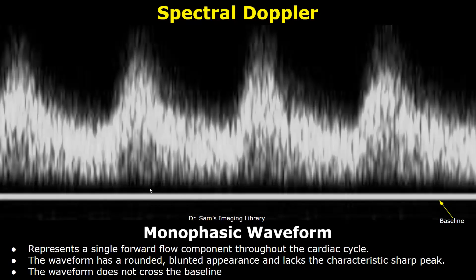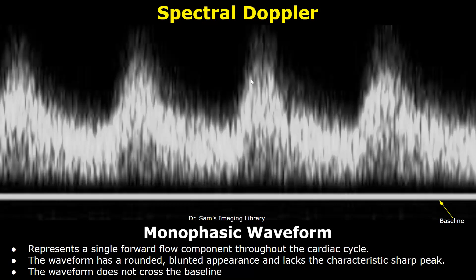Usually whenever a waveform is seen above the baseline it is considered forward flow, and when the waveform is seen below the baseline it is called flow reversal. This is a monophasic waveform, which means it only has one component — a single forward flow component throughout the cardiac cycle. A monophasic waveform will not have a sharp peak; instead we will find a blunt peak and a broad waveform, and the waveform will not cross the baseline.